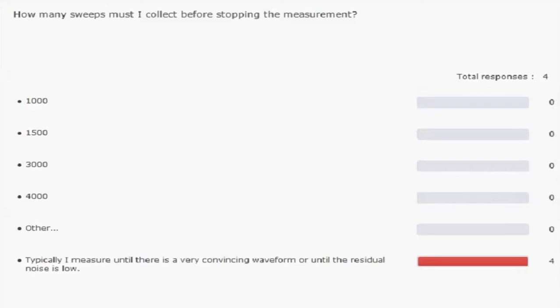As I mentioned before, I learned in the past to measure 2000 clicks. Historically, the number 2000 was picked because people needed a guideline so that they could be relatively certain that the measurement would have a low enough noise, but not measuring so long that it would be wasting time in most of the cases. And then the guideline came that if you measure 2000 sweeps, then in most cases where the patient is cooperating well enough, that is probably good enough. So people started doing that.